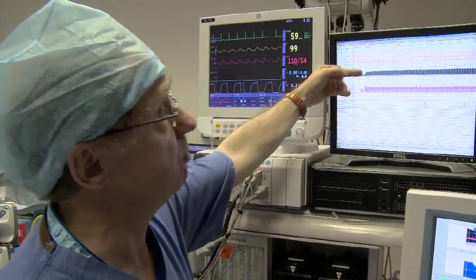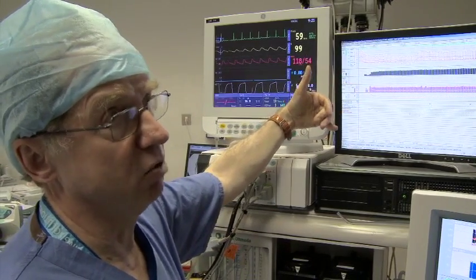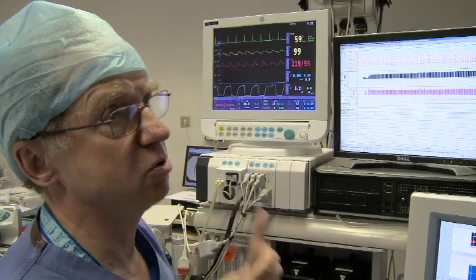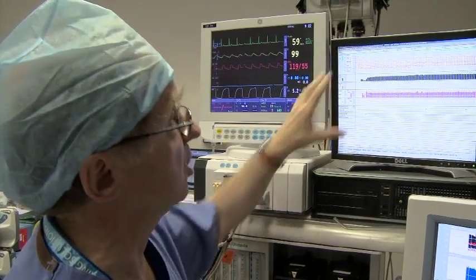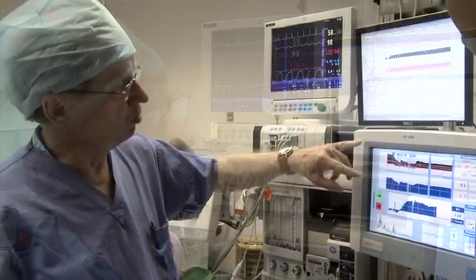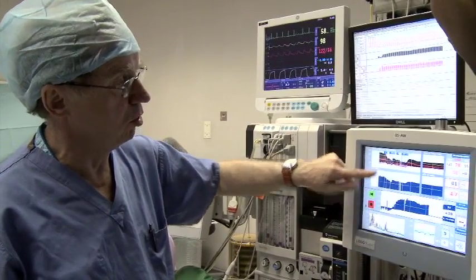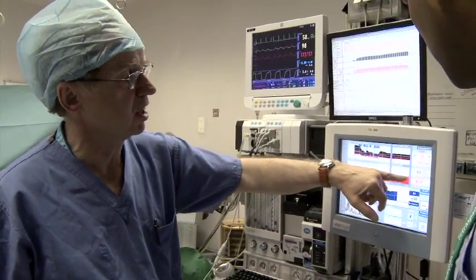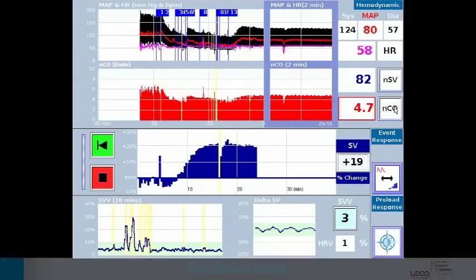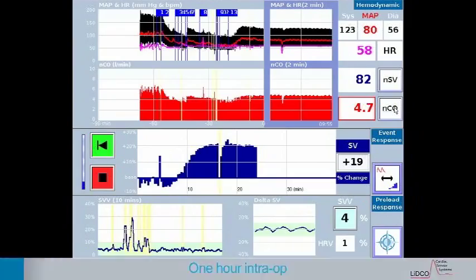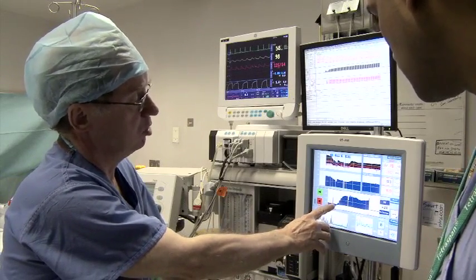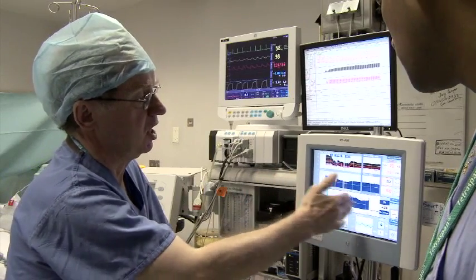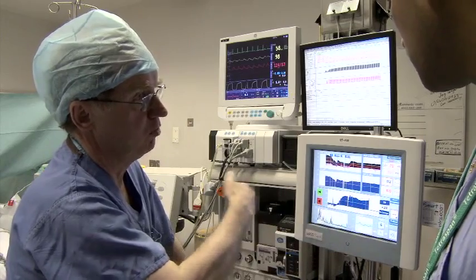We might also assume the fall was due to fluid depletion, so the automatic reflex would be to give fluid. We know from the LIDCO that the patient wasn't fluid depleted, because the stroke volume variation was low. This allows us to refine our intervention, which conventional monitoring does not allow. As we're showing here in blue, cardiac output fell at induction and is now back almost to its pre-induction level, which is what we're trying to achieve throughout the operation.